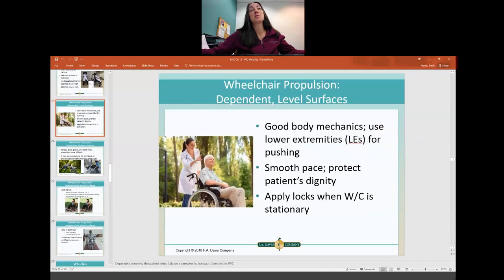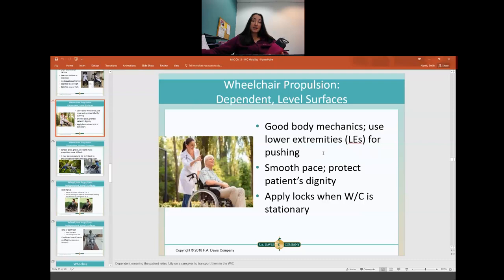For wheelchair propulsion on a dependent level surface, someone is pushing someone in a wheelchair on a flat surface. When pushing somebody, it's important to have good body mechanics, go at a smooth pace, and protect their dignity. Ask them where they want to go, explain what you're doing even if they can't verbalize, and let them know what's happening so they're an active part of the process. Whenever you get where you want to go, make sure you put the locks on — you're not safe until the locks are on.